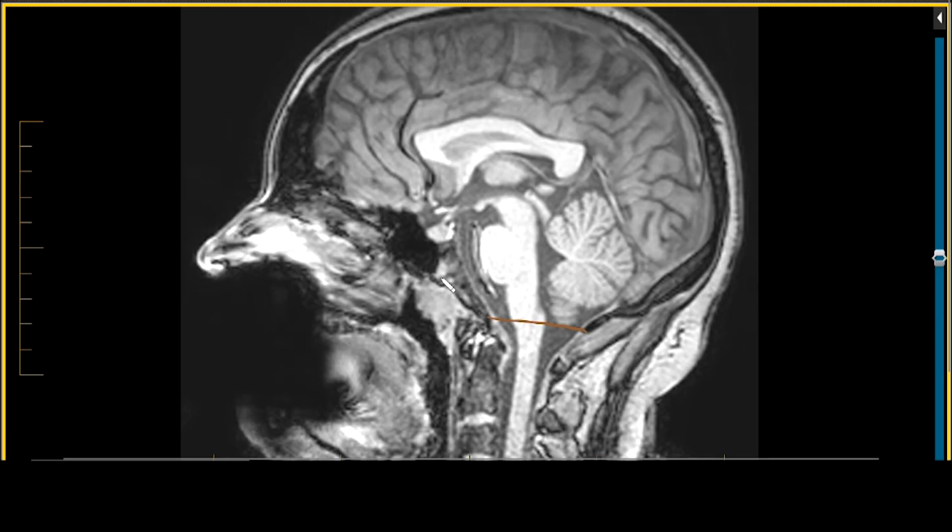You can have synchondroses here. You can have bone islands here. You can even have recruitment of red marrow in this flat bone structure, and sometimes that may produce some consternation when you're considering the diagnosis of metastatic disease. However, typically, red marrow fades or becomes less bright on the T2 weighted image, and when you inject it and do first pass imaging or delayed contrast imaging, the enhancement is little to scant, and that will help you differentiate it from something of importance or significance.